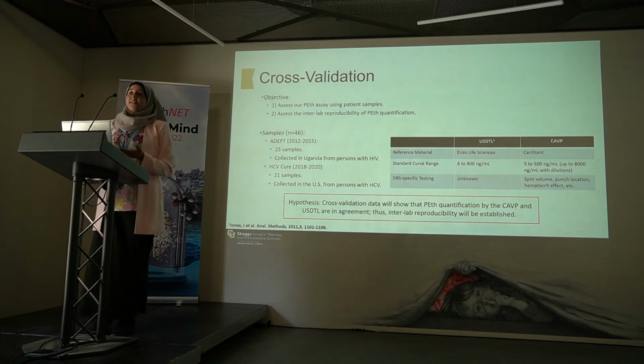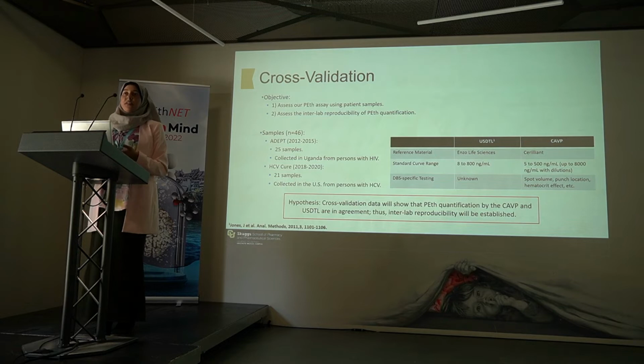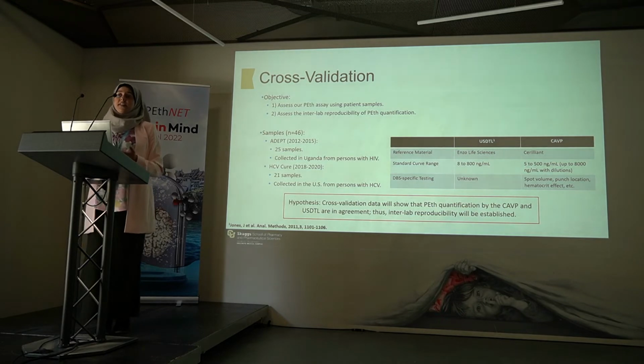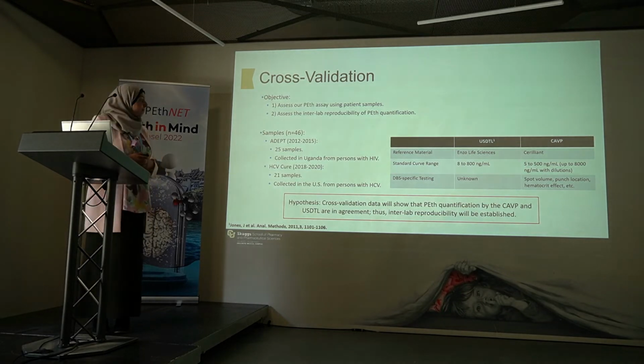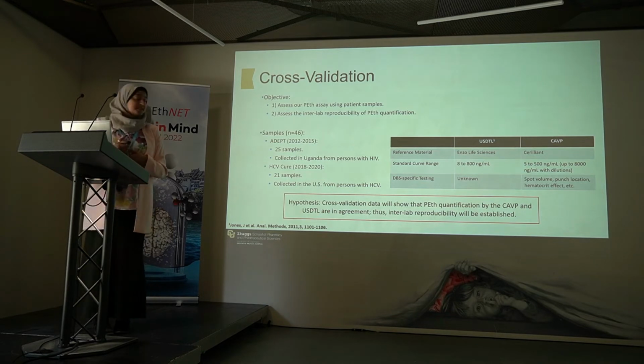And we had two objectives with this. The first was to assess our PEth assay using patient samples with authentic PEth, and the second was that in doing this cross-validation, we would be able to assess the interlab reproducibility of PEth quantification. So they agreed, and they sent us a combined 46 samples from two different studies.